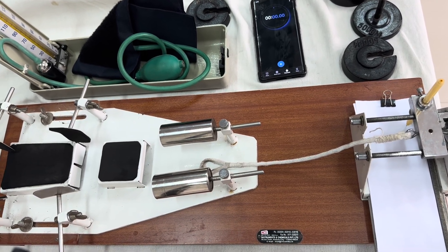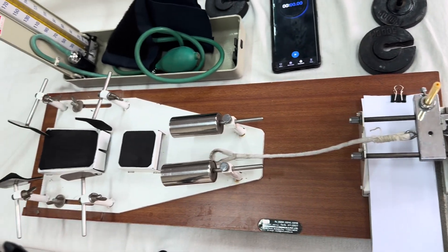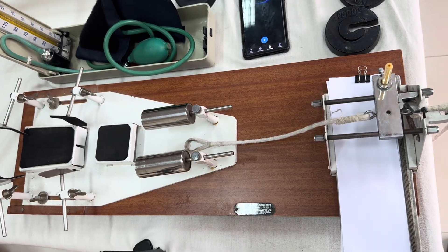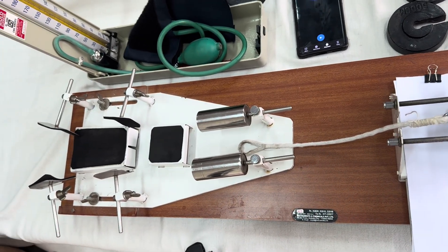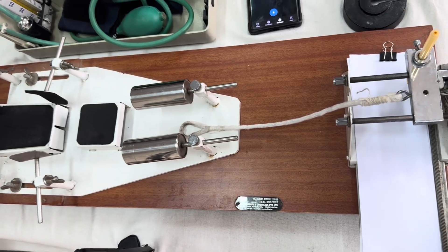Hello friends, today we are going to discuss about Mosso's Ergography. It is a very important topic in physiology, related to nerve muscle physiology practical for the first year MBBS students. First we will discuss what instruments are required. We require the Mosso's Ergograph.